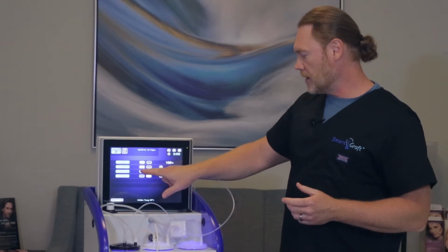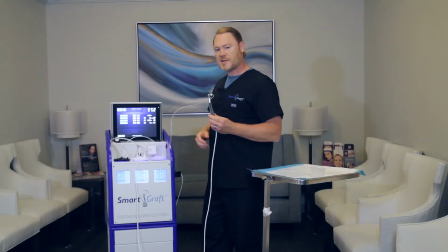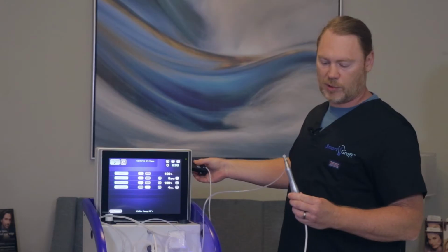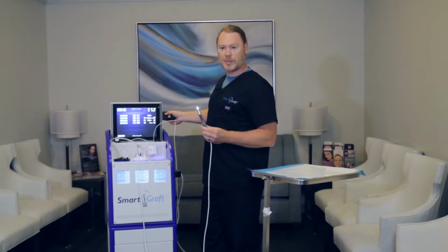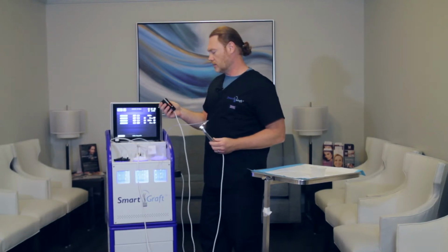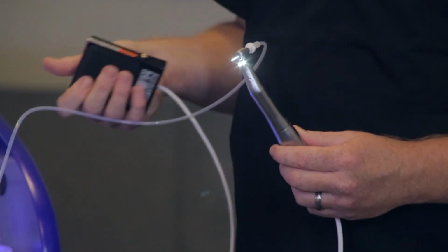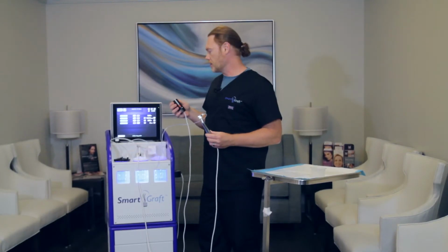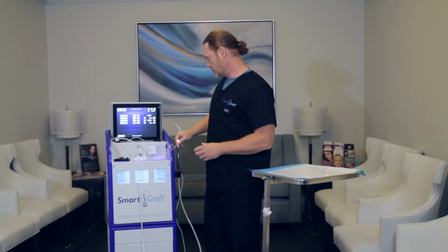The third button is the handpiece light. You won't actually see that come on until, again, you depress the foot pedal. It will stay on for a little bit, but it'll continue as you use the foot pedal. Now, one thing I want you to notice is every time I push that foot pedal, the graft count will increase. That is how the graft counter operates.